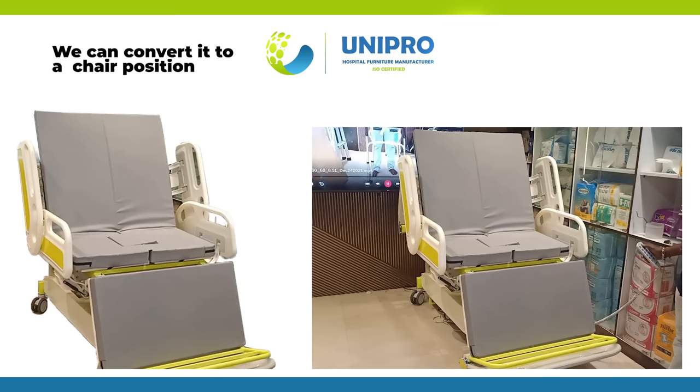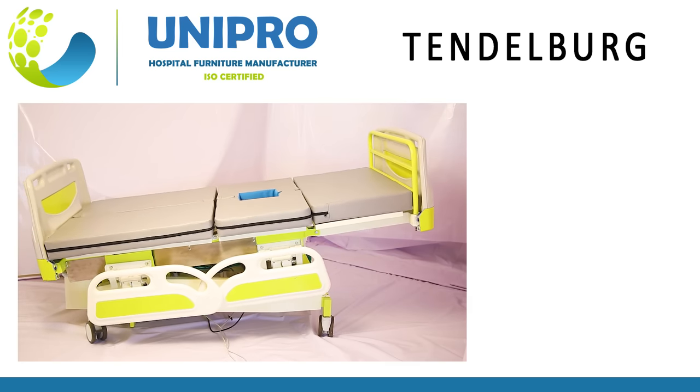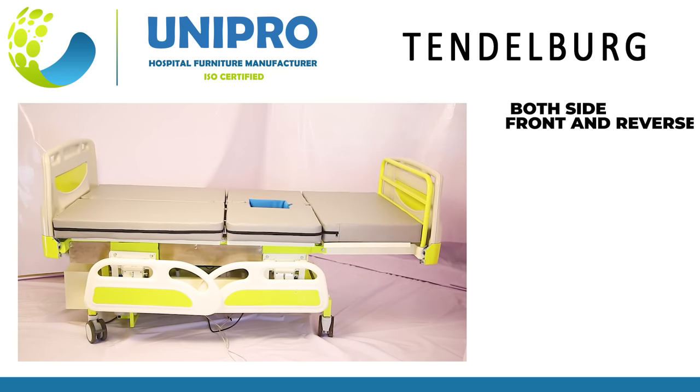We can convert it to a Chair Position. Tendalberg Both Side Front and Reverse.